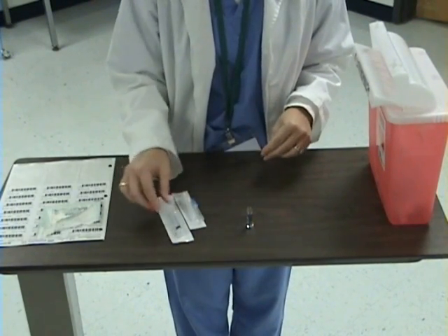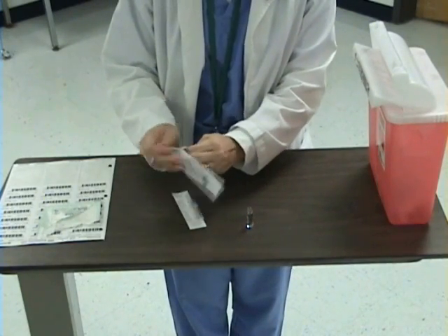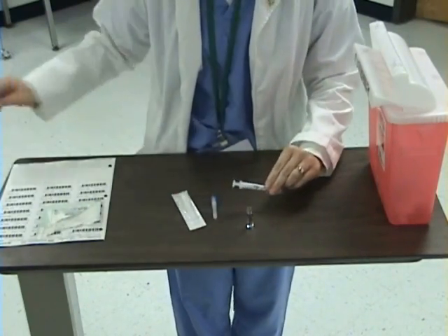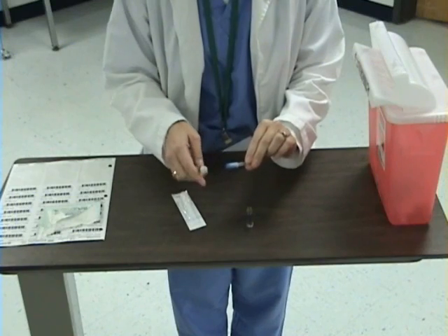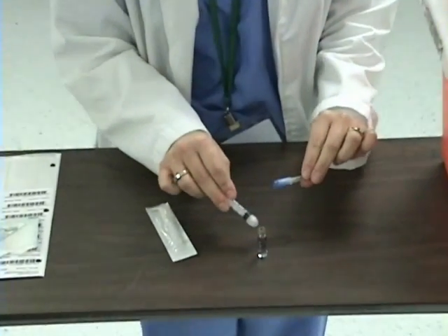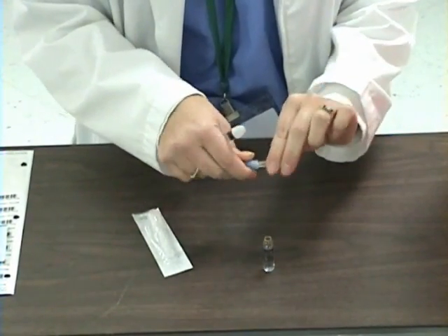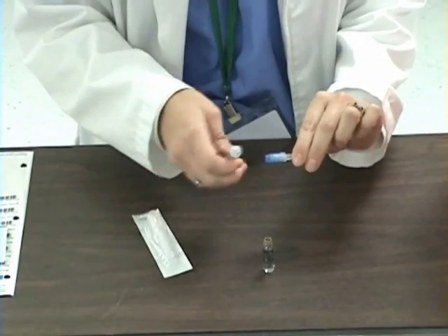Next, I am going to prepare my syringe so that I can withdraw my medication. Today I have a 3ml syringe. I am going to attach a filtered needle to my syringe. There is a potential that there are glass shards in my medication from opening this glass ampoule, and this filtered needle will keep the glass shards from being in my syringe and in my medication.